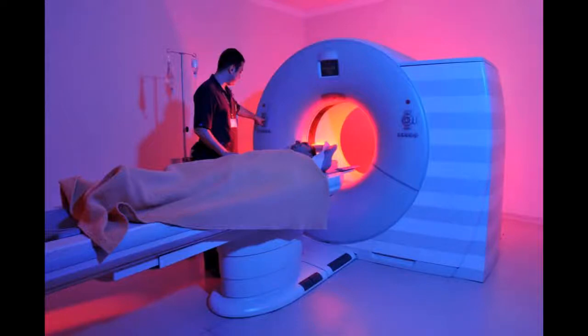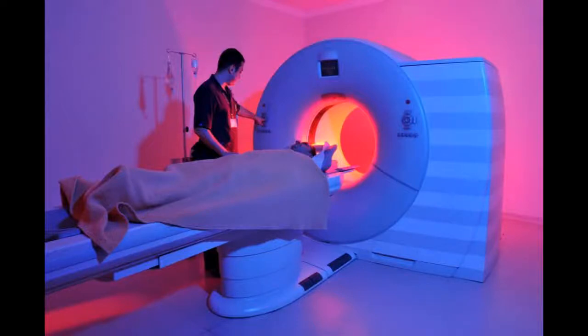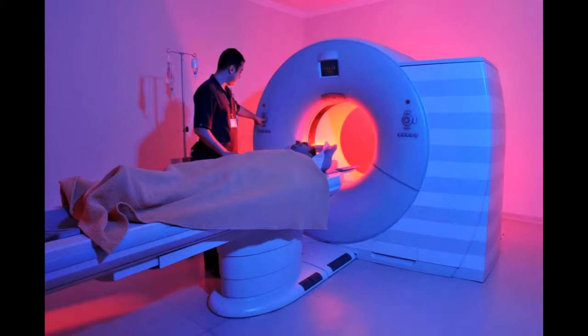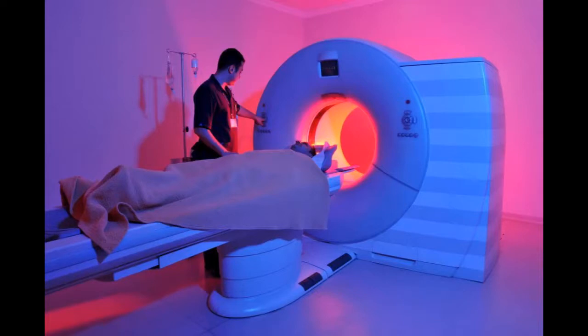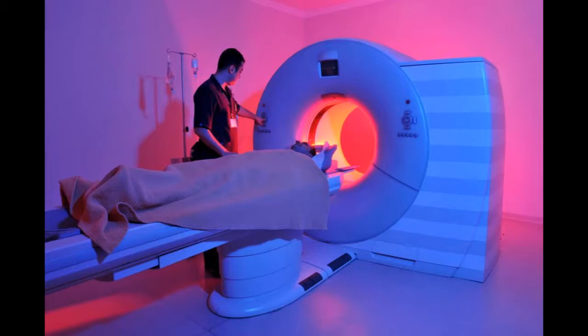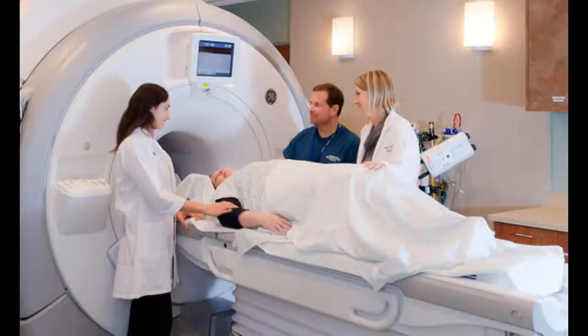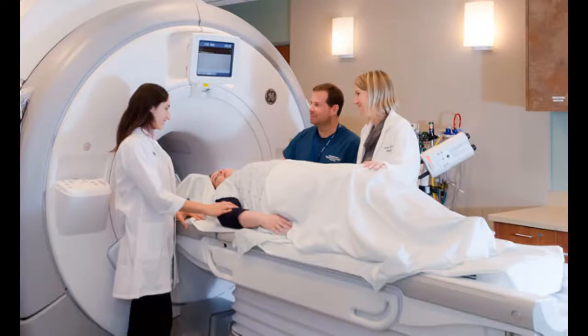Magnetic resonance imaging, or MRI, is a medical imaging technique used in radiology to form pictures of the anatomy and the physiological processes of the body. MRI scanners use strong magnetic fields, magnetic field gradients, and radio waves to generate images of the organs in the body.